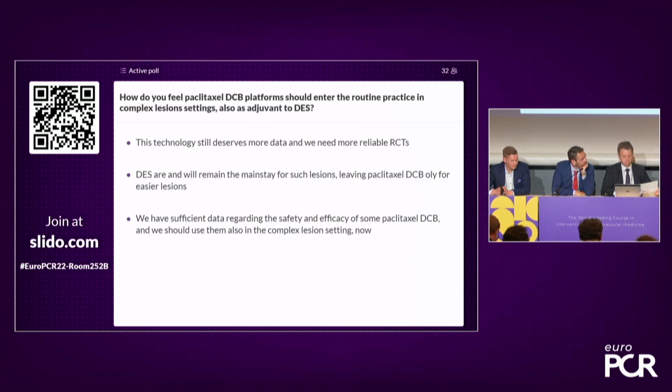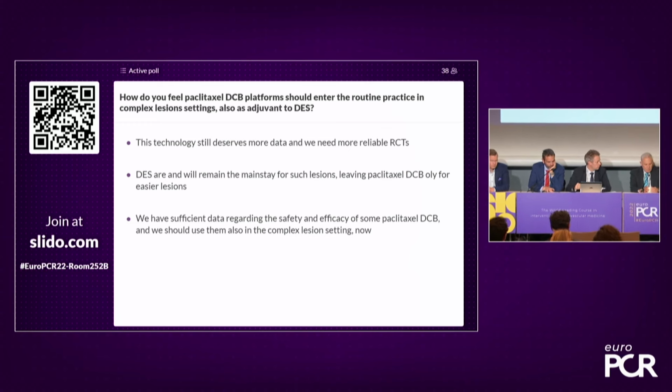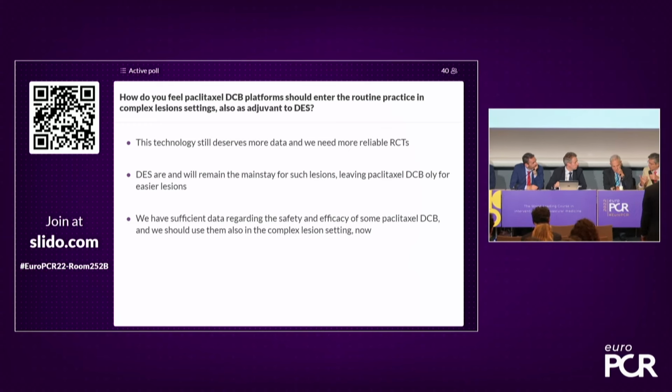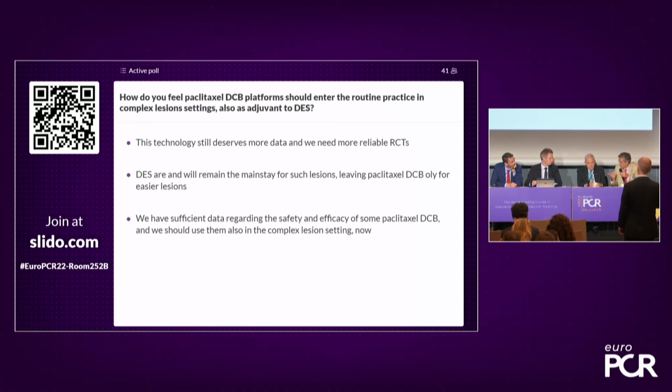a drug-coated balloon. But I find most people, experts in CTOs, most of them, probably because of the work you require to open the vessel, do still prefer to implant a stent with the feeling that the vessel will remain open longer. It's a major work. Probably this is a bias, but most CTO people will say, well, in this case, after 2 hours, 3 hours, I will fix it with metal.